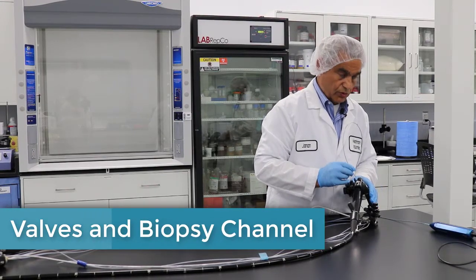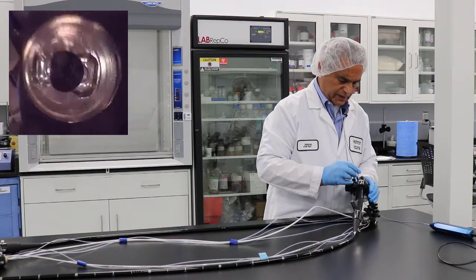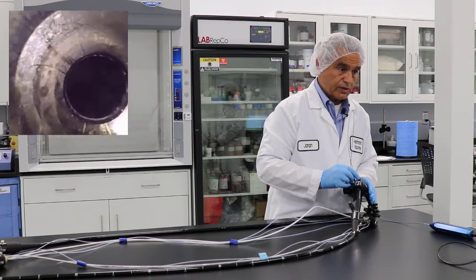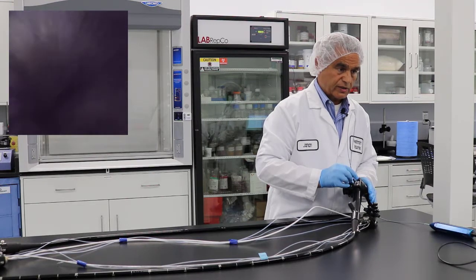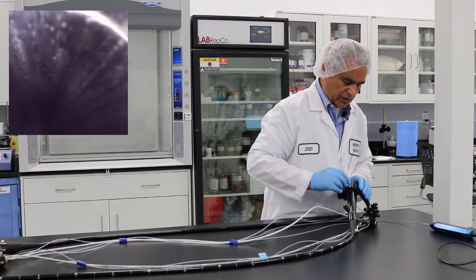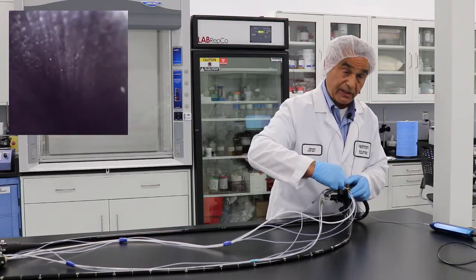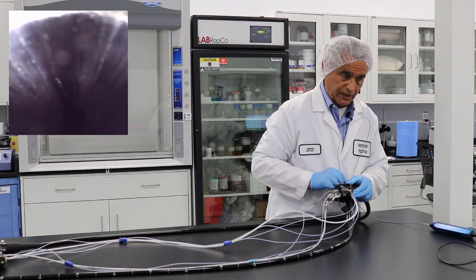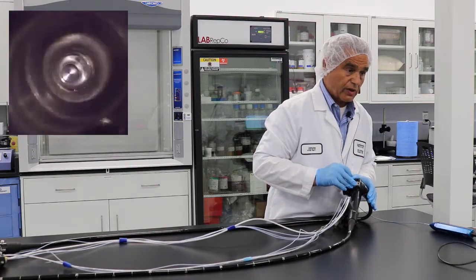We're going to use the flexible inspection scope to inspect this scope. Usually you start from one end — either the proximal or distal. Here we can start from this point and slowly advance your scope until you see some debris or whatnot. As you see, I see some areas that need some attention. You don't want to force it — right now I encounter some resistance, and the reason is because we have these 90-degree angles. You don't want to force your scope through that 90-degree angle or you will damage it.